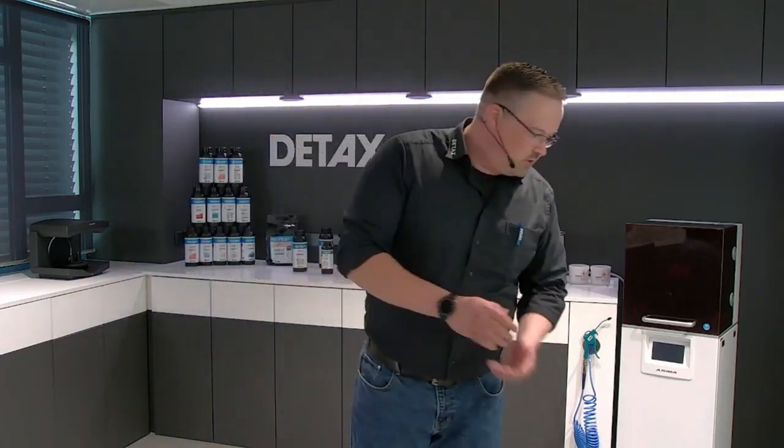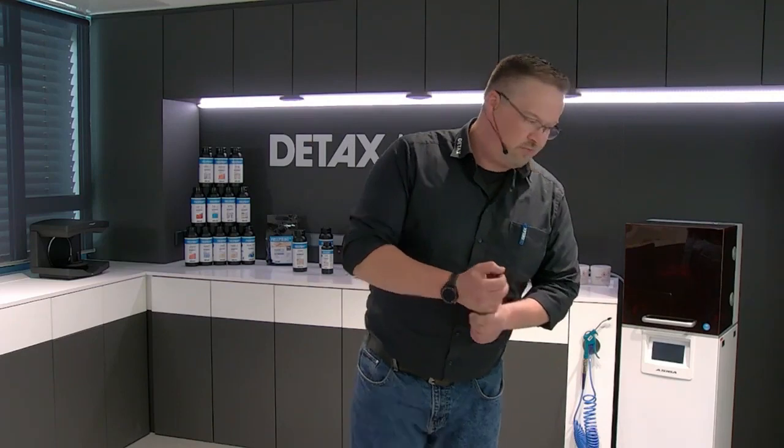Okay, the next question. The shelf life is one question, and how long you can use it in the mouth. The shelf life is at the moment 2 years. I'm sure it will be 3 years in future, but to validate the 3 years process, you need more time. That means this is a brand new material. So in 1 year or 1.5 years, we can talk about 3 years shelf life.